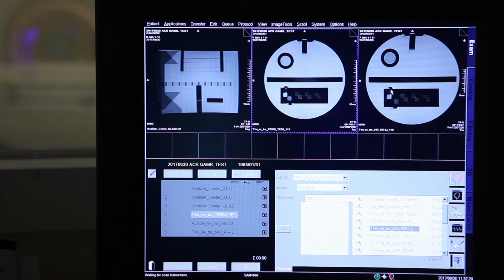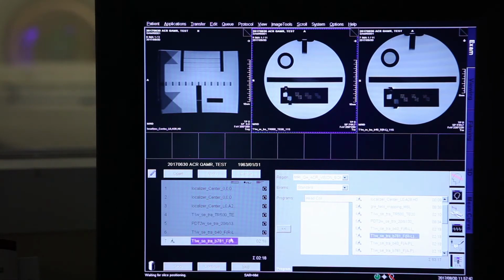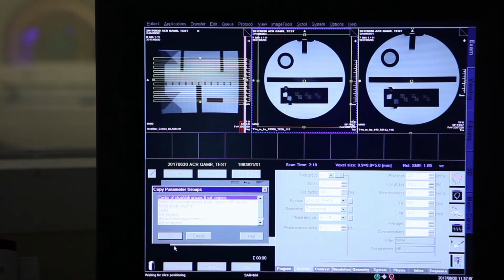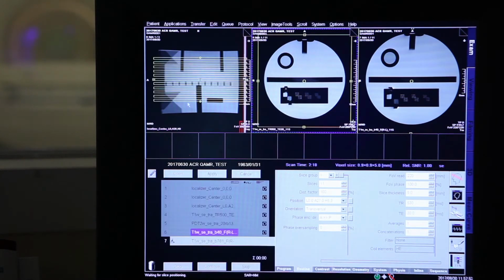You have the problem. There is also the susceptibility artifact which is here, so you can see these structures, which are high contrast structures, and you have this problem here. And now we'll repeat the sequence with a higher bandwidth, and you're going to see what happens. Okay? We take the same sequence again. Be aware to have the same axis, otherwise we're shifting. You cannot subtract, that's the point. So we copy all the parameters, we have it there, and now we're about to do the same sequence with a higher bandwidth. The highest bandwidth possible.